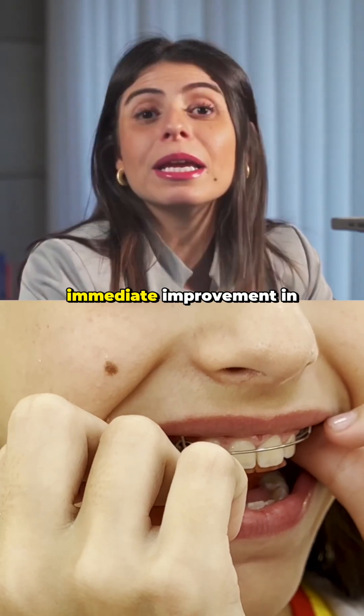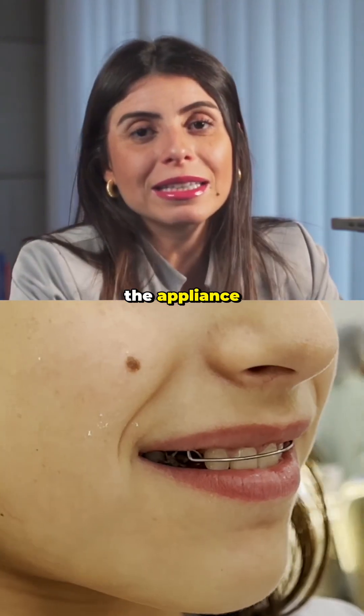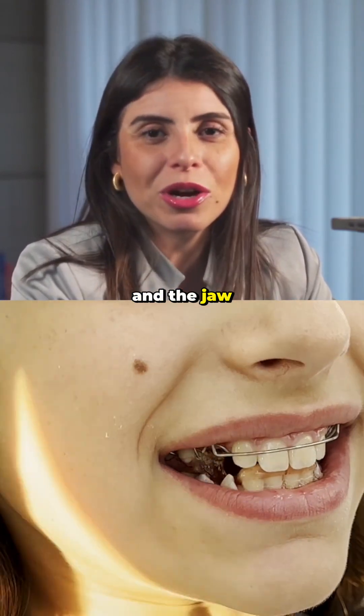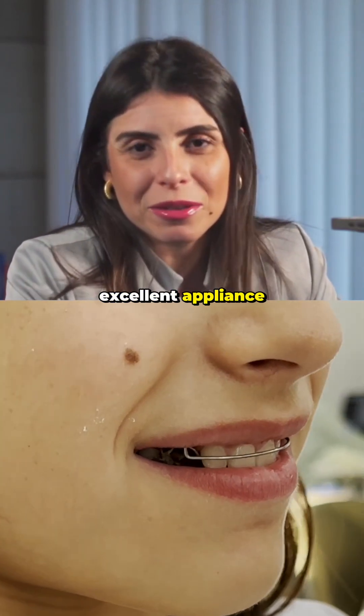Notice that there is an immediate improvement in the profile as soon as the patient places the appliance inside the mouth. We then continue with control visits until there is neuromuscular adaptation and the jaw is positioned in centric relation in a more anterior position. It is an excellent appliance.